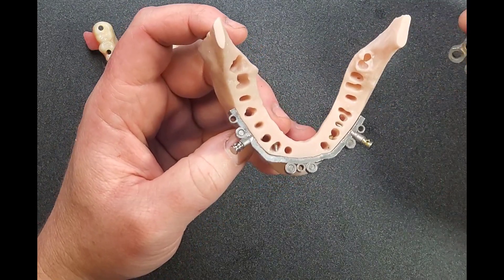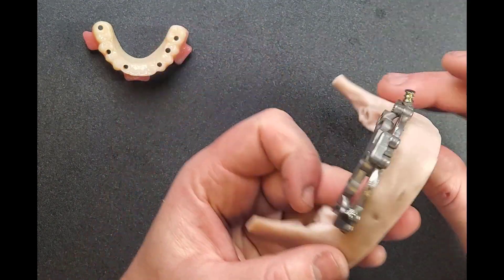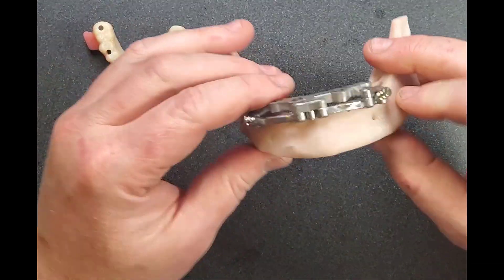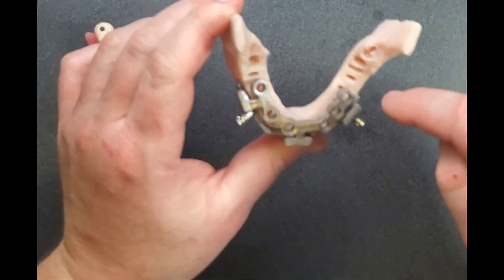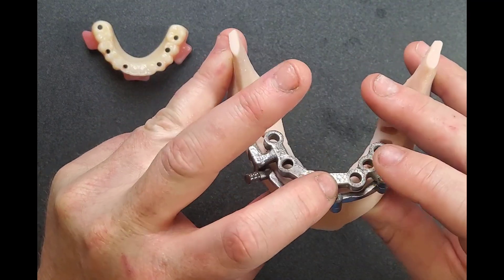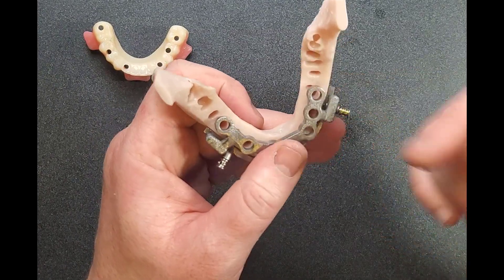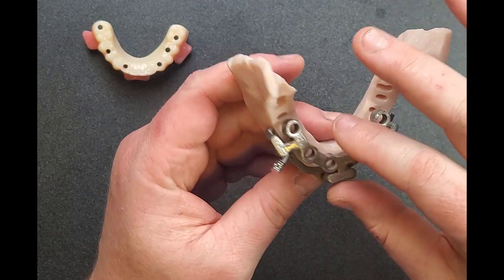Bone reduction has been completed. Now you would take your magnetic drill guide and this would just drop into place. Very nice and stable. Put the pin back in — don't turn your patient upside down and do that because your pin might come out. But now you've got your magnetic drill guide and you can drill each of your implant sites. There is no chance that this thing is moving on you during use. It's just really, really stable. The most posterior pin is actually even with your distal-most implant site, and so that's going to keep you from having any kind of deviation of the guide.